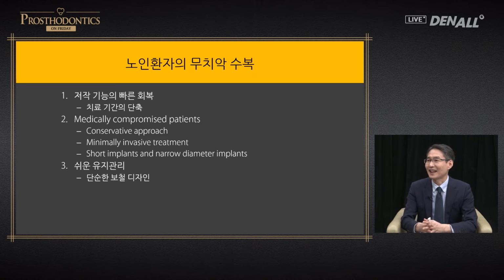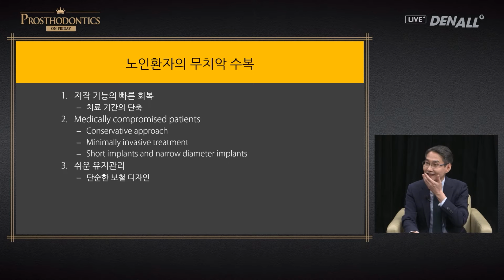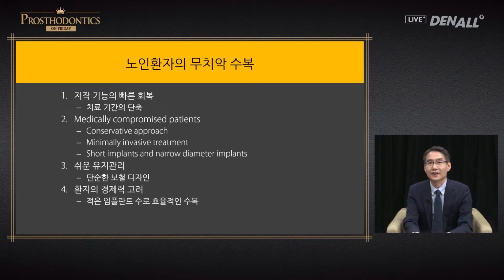There are many patients who cannot take care of oral hygiene very well. Those who are sick, yes. If possible, we need to provide a prosthesis where self-cleansing is made easy, even if the patient does not really brush their teeth, with just the rinsing of the mouth. We need to design it so that the food debris comes out easily. And we need to factor in the patient's economic condition.